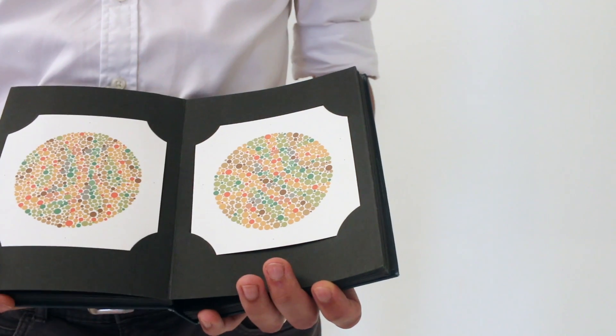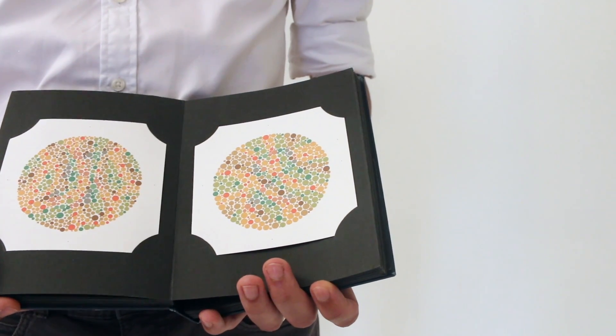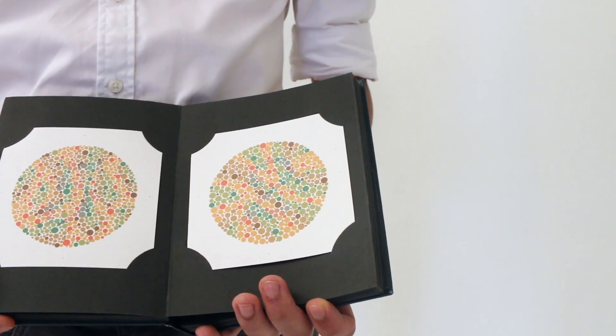You score the Ishihara out of the number of plates you've tested and the number of plates that the patient's got correct.